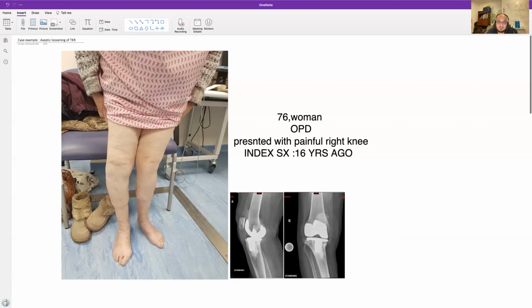Intraoperatively, the steps are exposure, implant removal, and reconstruction. Exposure should have a longer incision, extended medial parapatellar approach, doing synovectomy all around the knee, clearing the gutters, obtaining samples for microbiology examination, and a tibial tubercle osteotomy should be an option if we struggle to expose the knee. I will start by careful removal of the implant in sequence, polyethylene first, then the femoral component, then the tibial and the patella at the end.